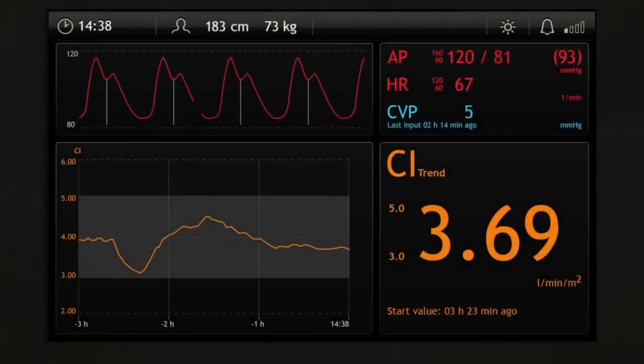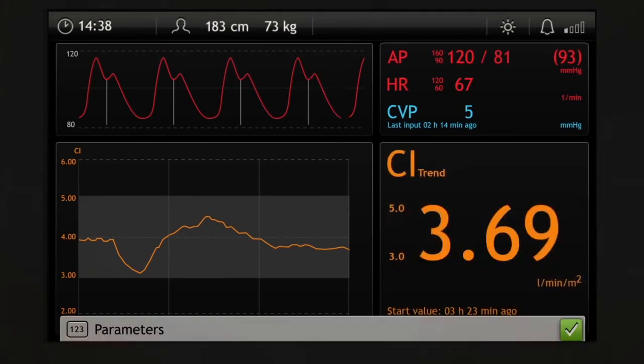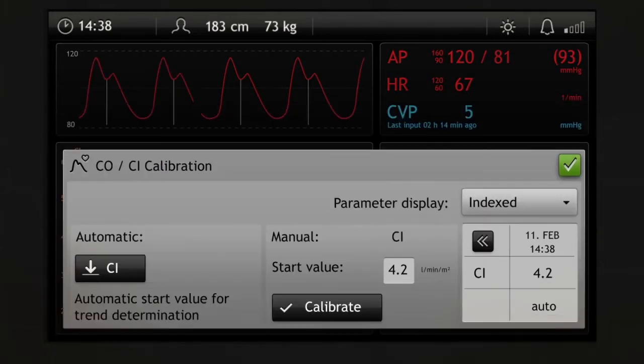To calibrate Proact, press on the CI field and tap the Proact button. Tap the CO CI button for an automatic start value calibration, or alternatively, enter a CI from an external source, e.g., measured by echocardiography.